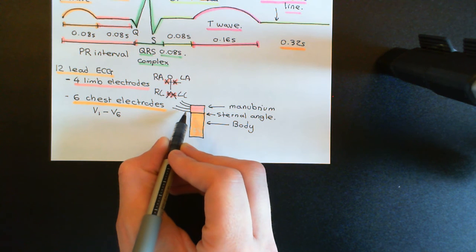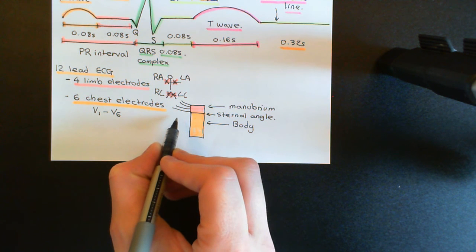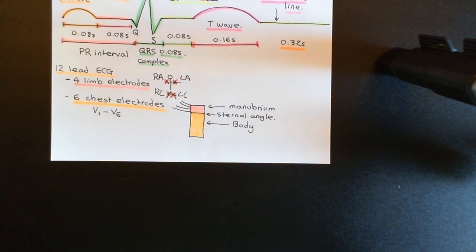Then you should be able to go down to another rib below that, which is the third rib. Then go down into the space below that, you'll find the third intercostal space. Then go down to the rib below that, that's the fourth rib. And then go down into the space below that, that's the fourth intercostal space. So I hope you have now been able to find on yourself your fourth intercostal space.